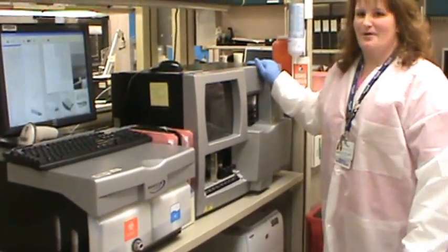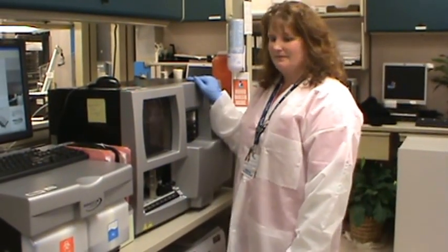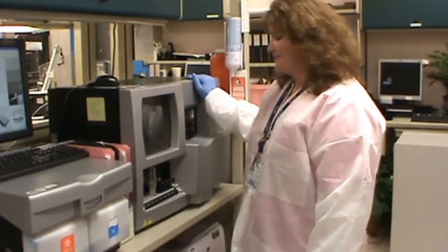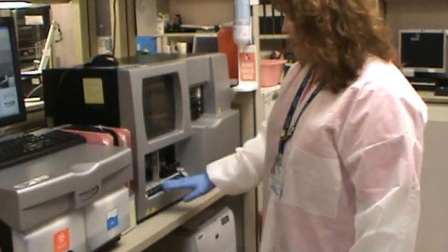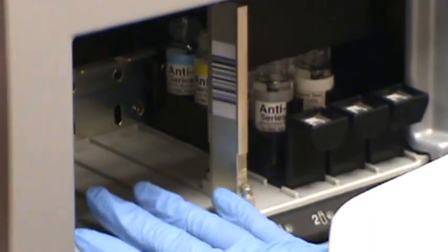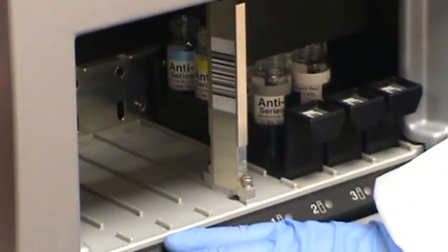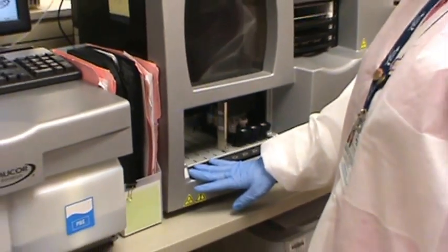This is the instrument module. Inside the instrument module, you have one probe that samples patient samples and reagents. You have your sample loading bay and your reagent loading bay. On each side, there are barcode readers that will read the barcodes for your samples. Your sample barcodes will include your patient identification, the name, and any pertinent information your LIS has set up.